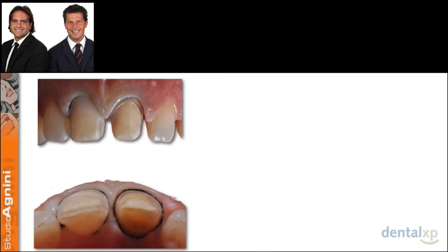And here you can see that we wanted to test the system with different finishing lines, horizontal on number 8 and vertical on number 9. Before prepping the teeth, we performed a whitening on tooth number 9, which was discolored.